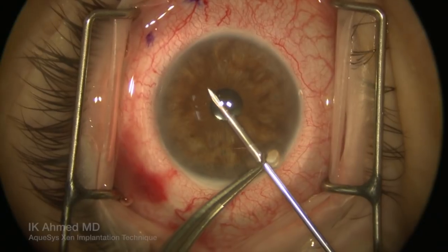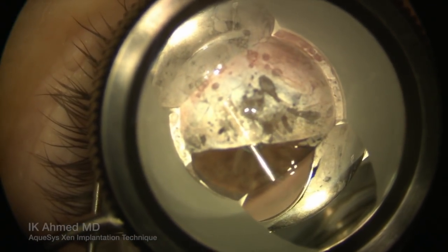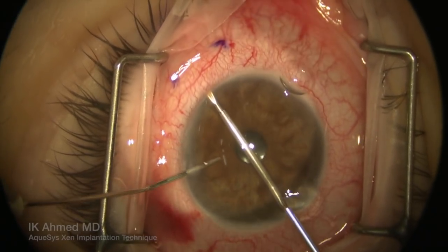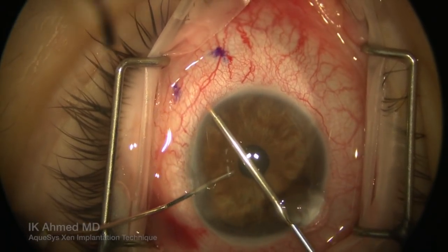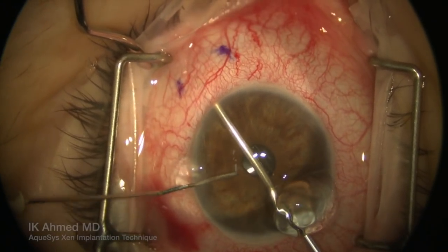The needle is then inserted into the anterior chamber, and the entry point into the angle is facilitated with the use of a gonio mirror to enter at the level of the meshwork, pushing the needle now through the sclera in a direction so it emerges from the sclera at about three millimeters posterior to the limbus.